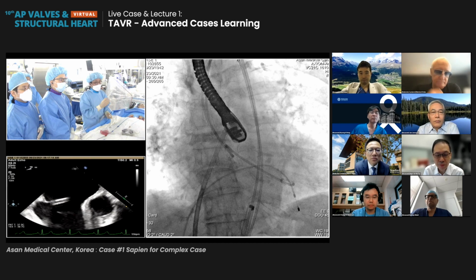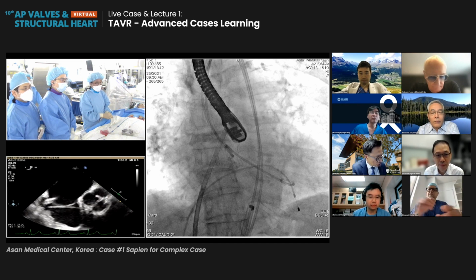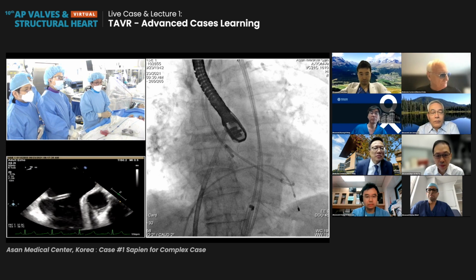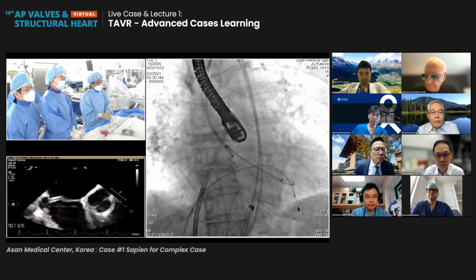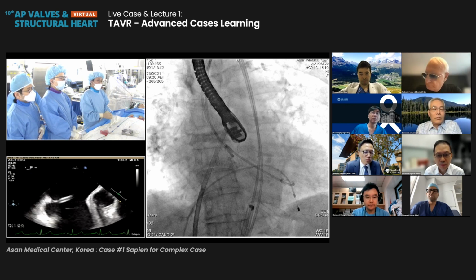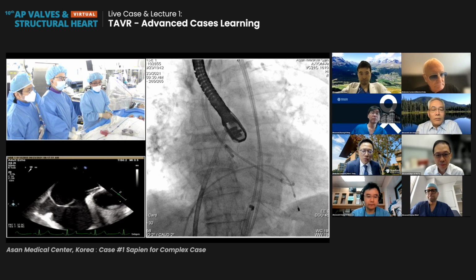Yes, right. I already mentioned that these parameters were measured in the presence of aortic stenosis, so just fixing the aortic stenosis, the hemodynamic parameters would change. Academically, the process that you described would be ideal, but practically, this patient is a very old woman, and it would be very impractical to get her back on the table when she really has a continued indication for ASD closure. So that was our consideration.